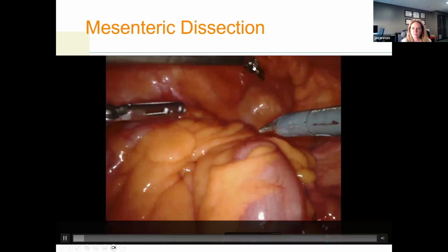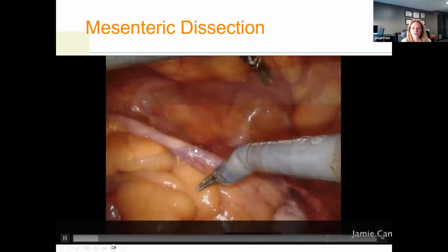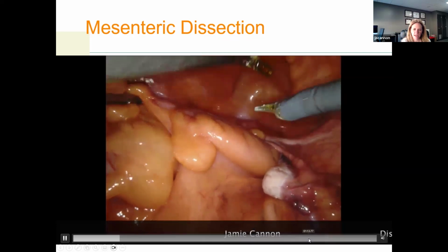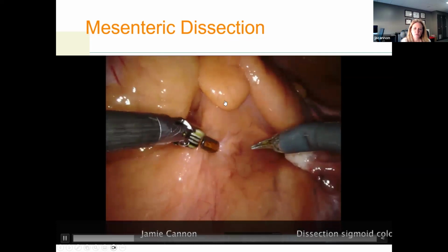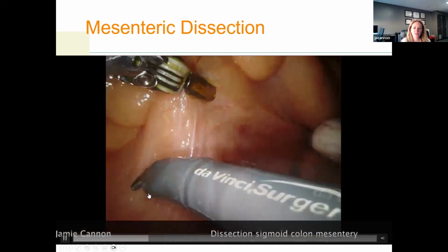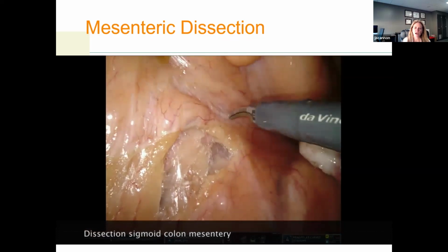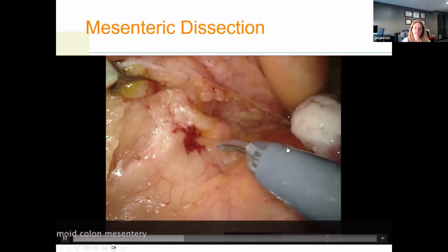So here we're starting. You see my bipolar, I just lift it anteriorly to get it out of the way. And then my grasping retractor is going to hold the redundant rectosigmoid up and put the mesentery on some tension so that we can see where the IMA is coursing. And then I'll come down with my bipolar. So we can see here where the IMA is running. I lift that up with my bipolar, and then we're going to score the peritoneum underneath the IMA and find our plane. You want to be careful that you're staying right underneath the IMA. You can see the pointer there showing where that plane is.